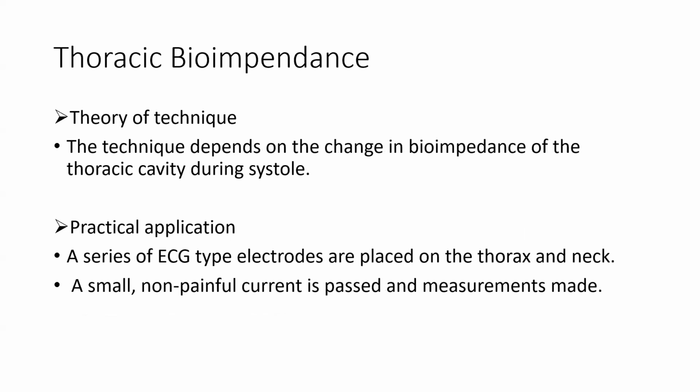Thoracic bioimpedance. Theory of technique. The technique depends on change in the bioimpedance of the thoracic cavity during systole. Practical application: a series of ECG-type electrodes are placed on the thorax and neck. A small and non-painful current is passed and the measurement made.